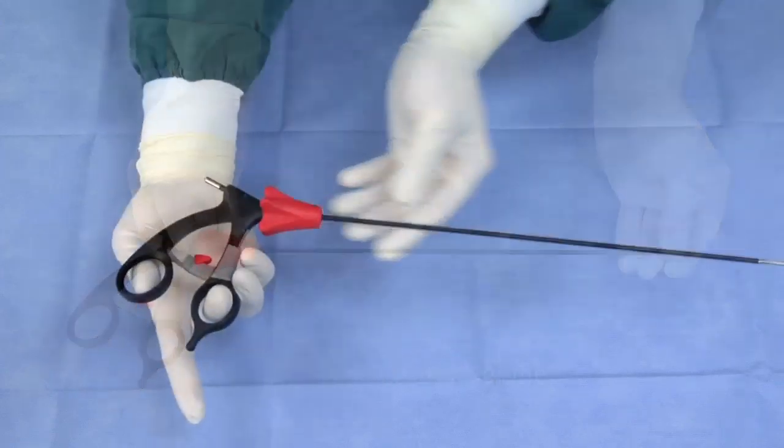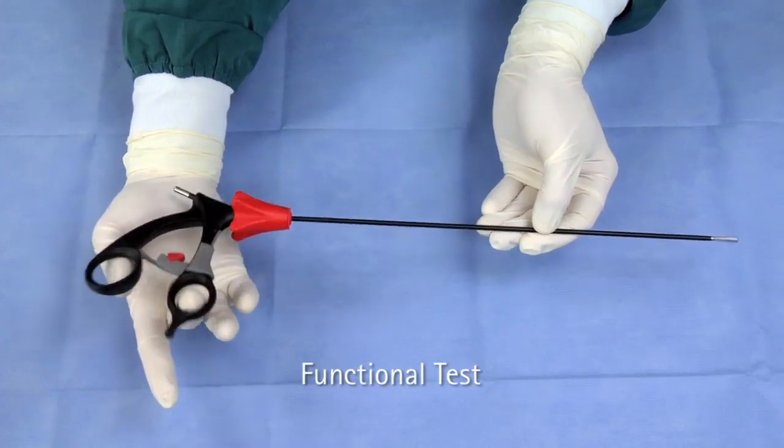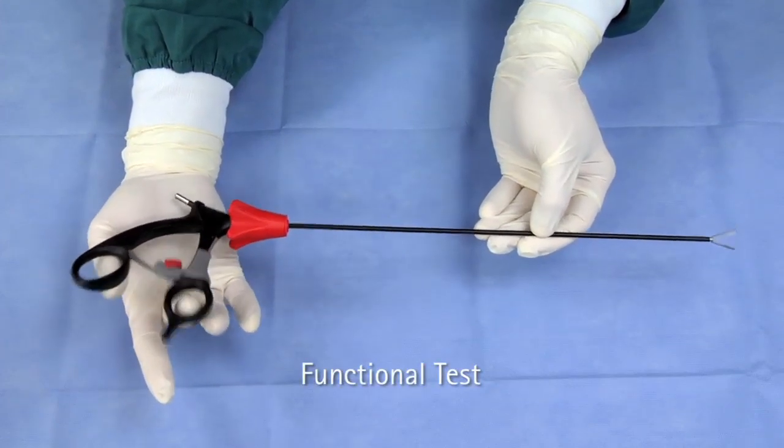Test the assembly of the instrument by opening and closing the handle. This will ensure the jaw is functioning properly.